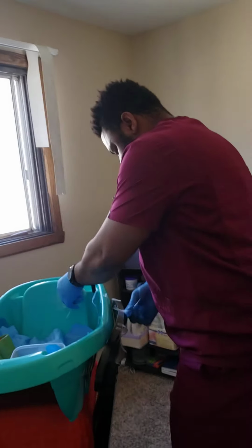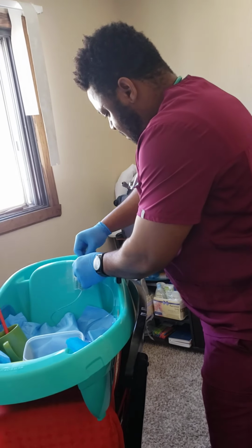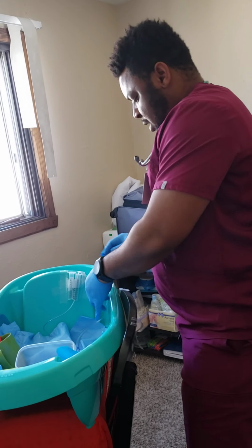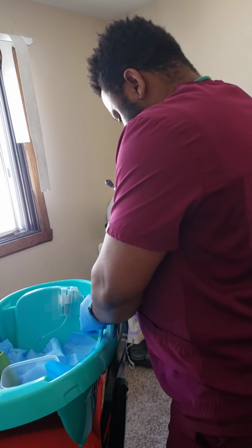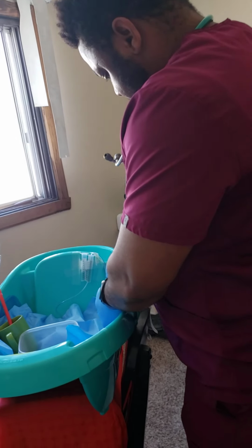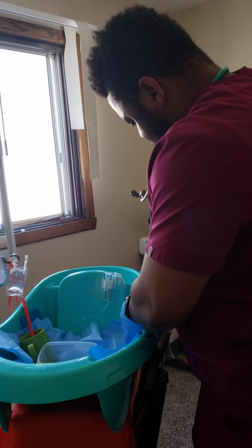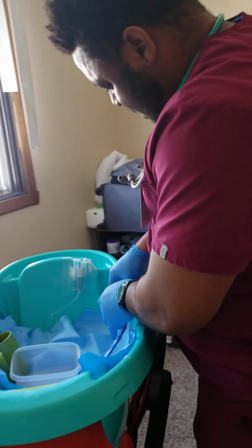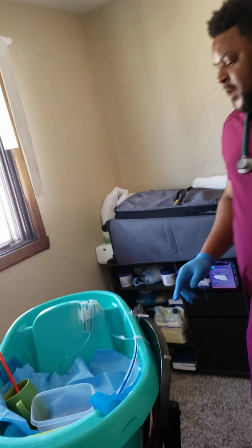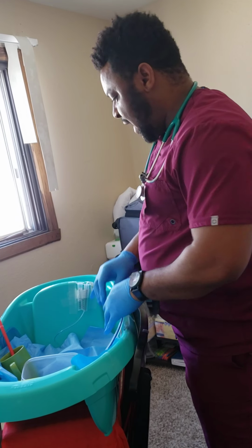Then I'll grab my tape. I'll tape the tube to the patient's nose, and I also want to put a little tape on the patient's gown right here to hold the tube in place, but making sure that the patient is able to relax and turn their neck without any problems, without removing the tube. So I make sure the tube is all relaxed.